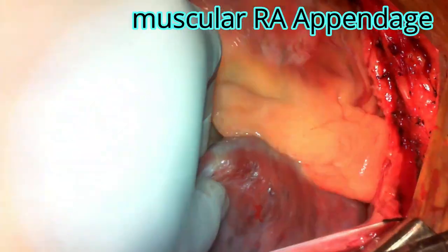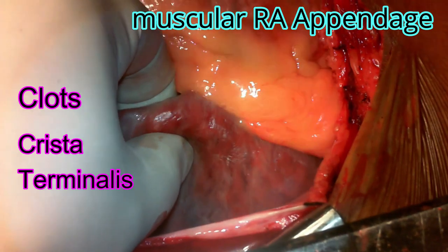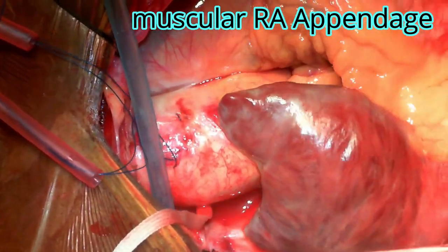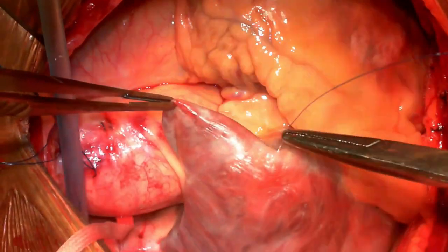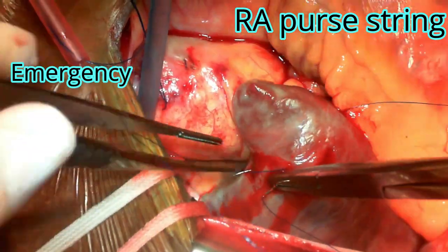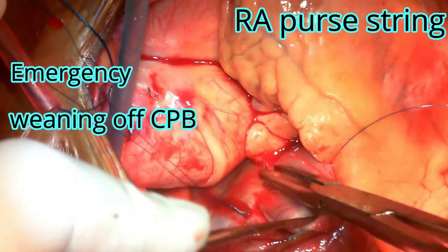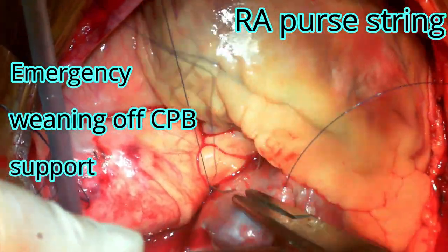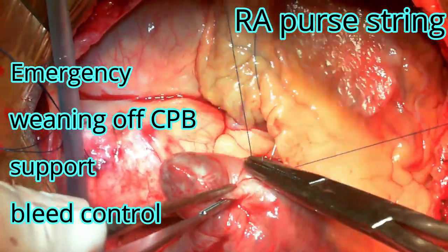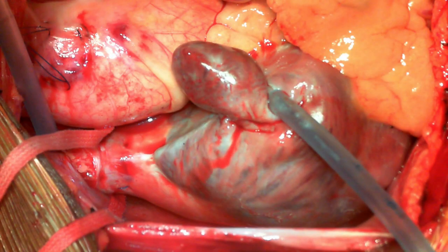You can also make preparations to place an RA purse string or open the RA appendage. In chronic cases, there may be clots, or the crista terminalis and muscles in the RA appendage may be very prominent. Taking an RA purse string is helpful for three reasons: first, you can establish cardiopulmonary bypass by opening the RA appendage; second, you can then handle the SVC and IVC separately after going on bypass with the RA cannula, avoiding hemodynamic compromise; third, it is useful in emergency settings and when coming off bypass after bicaval cannulation, or when brief CPB support is needed.